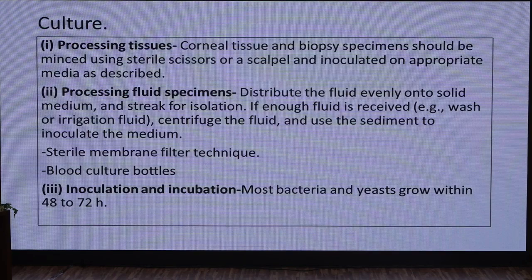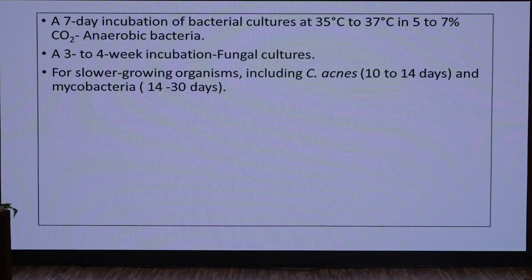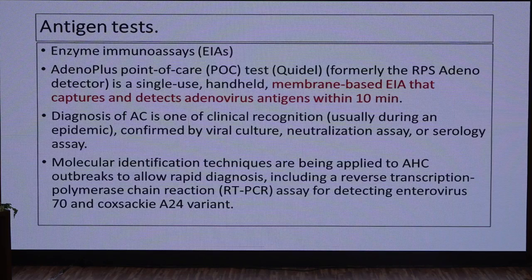So in case you are sending vitreous samples, you can ask for this Bactec and Vitek. And again, the time is obviously different because most bacteria and yeast grow within 48 to 72 hours. Even a 7-day incubation period is required for anaerobes. For fungal culture, it's more, and also for mycobacterium.